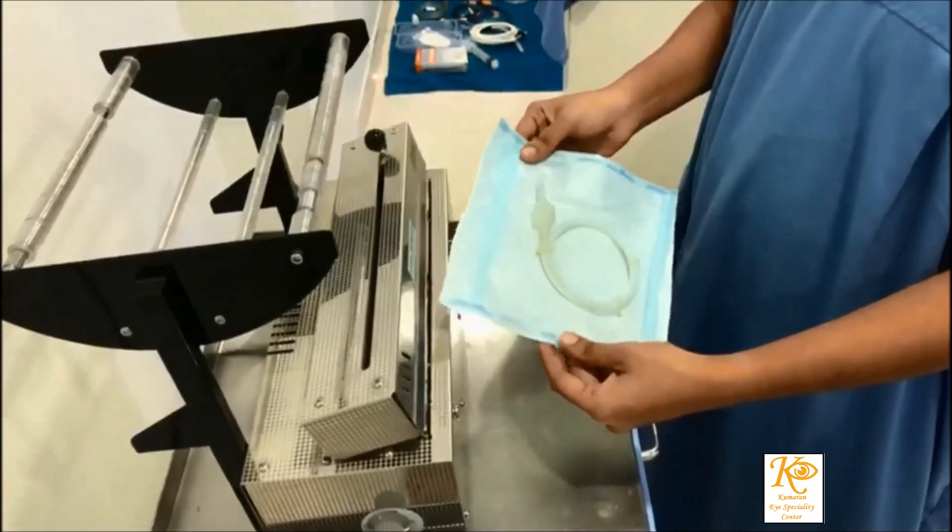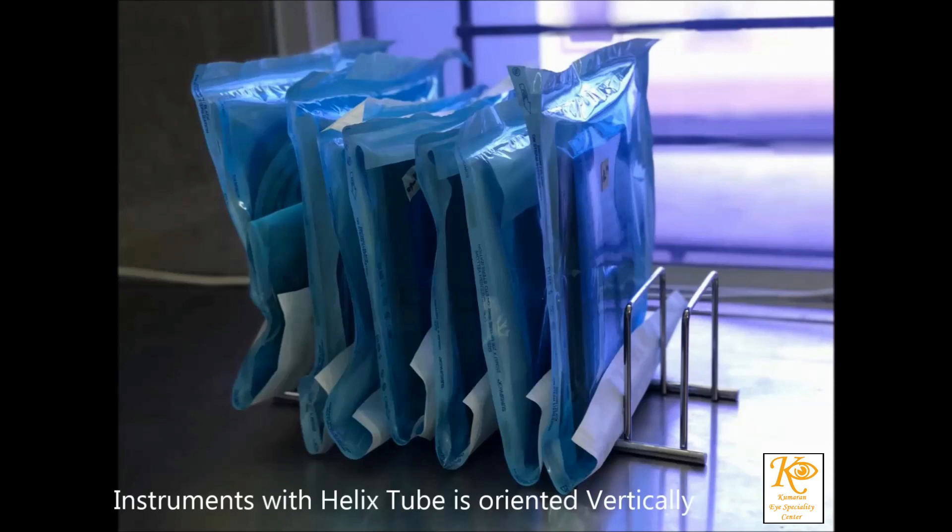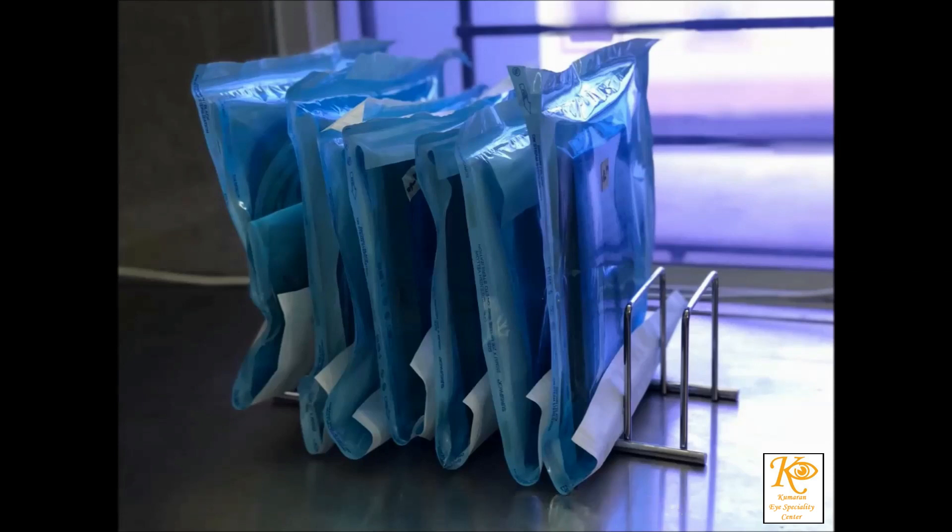The Helix tube is then placed into the sterilizer pack and sealed well. Alternatively, the Helix tube can be placed into the linen load in the bin and loaded into the autoclave.